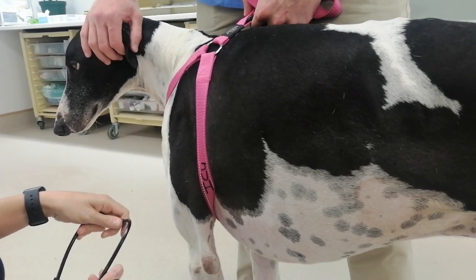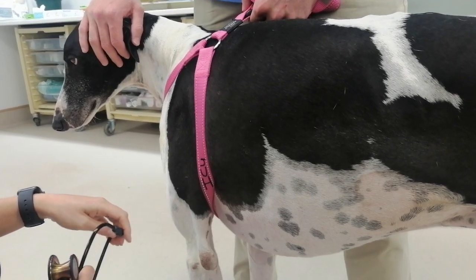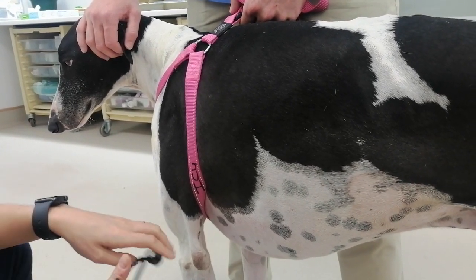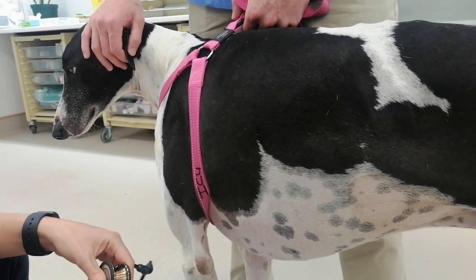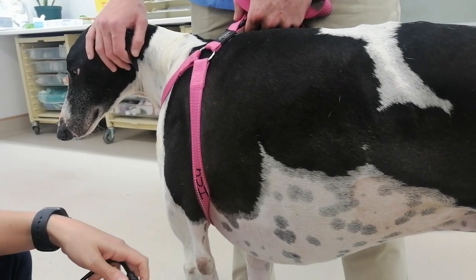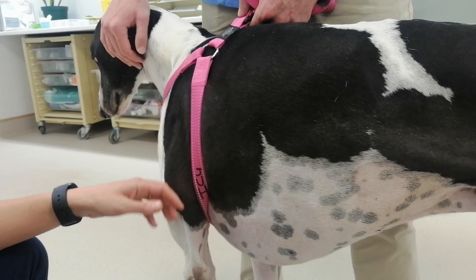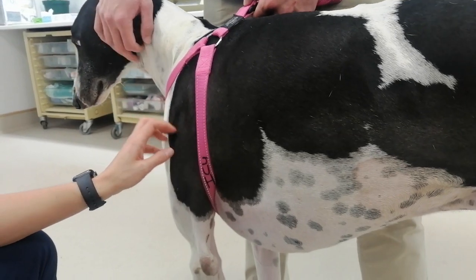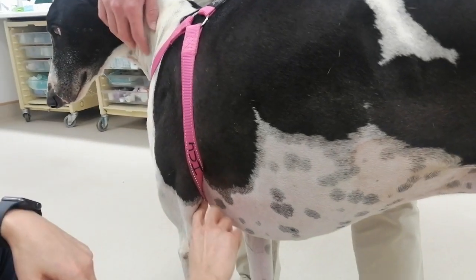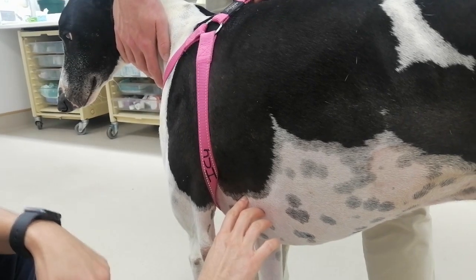After doing your pulmonary auscultation you can evaluate the heart. The first thing you need to do when evaluating the heart is find the point of maximum intensity, which is usually over your fifth intercostal space. You can count the ribs until you reach the fifth intercostal space.